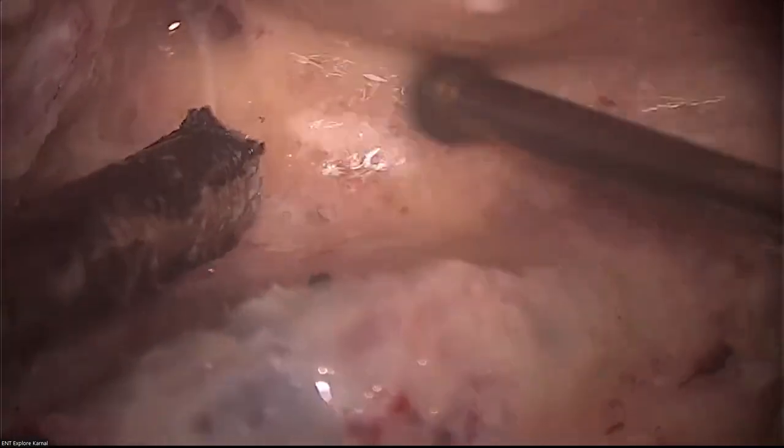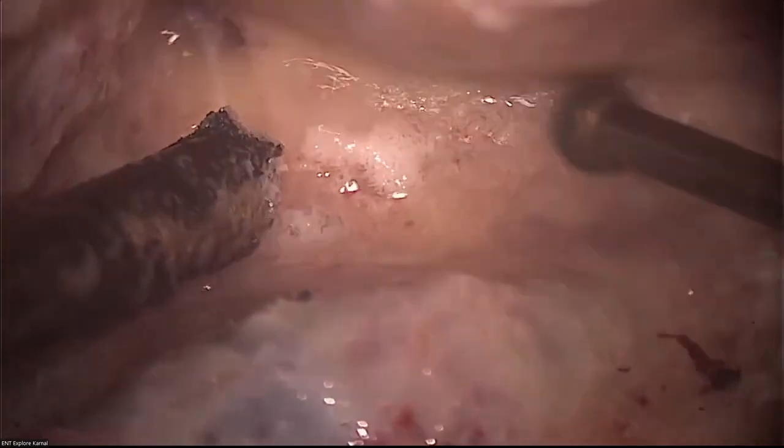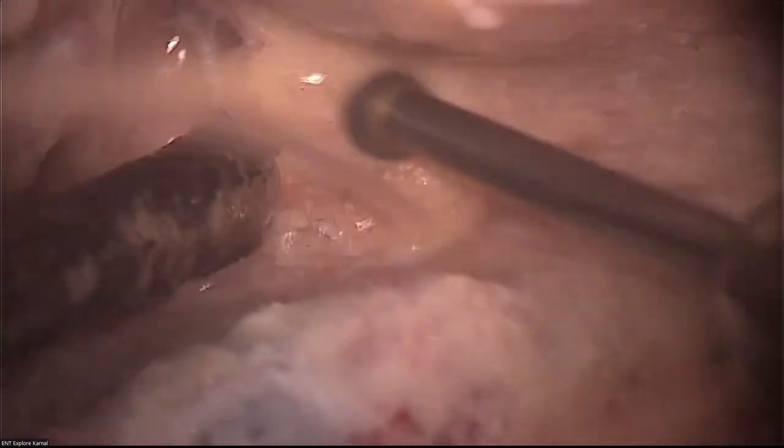Run parallel to the incus. If you run parallel to the incus, your facial nerve is always below.